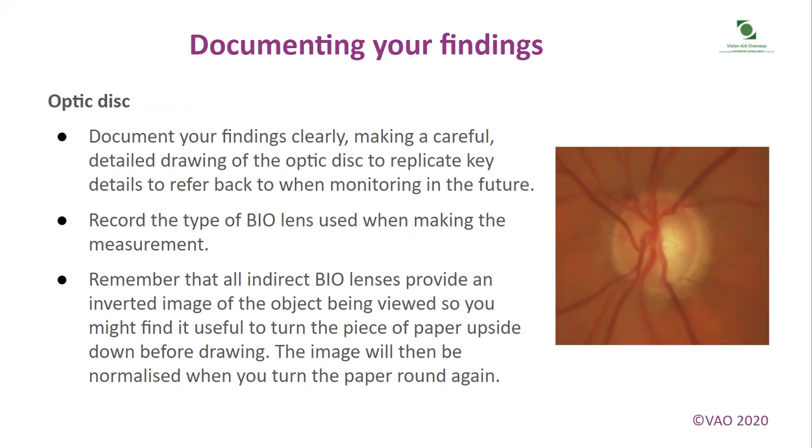Documenting your findings. Optic disc. Document your findings clearly, making a careful, detailed drawing of the optic disc to replicate key details to refer back to when monitoring in the future. Record the type of BIO lens used when making the measurement.